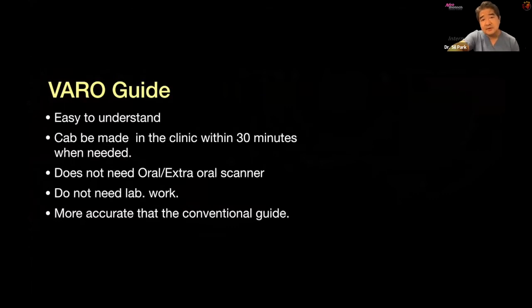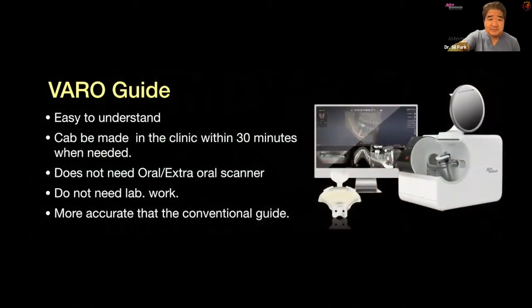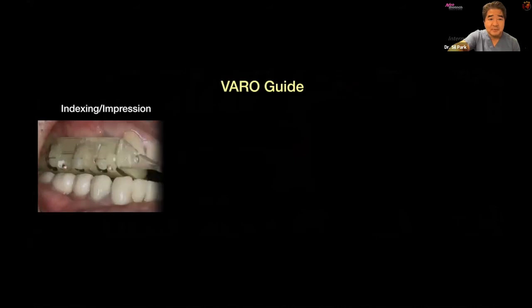We discussed those tolerances, right? The gap between the guide and tools, and the gap between the drill and sleeve, has some built-in errors. But the VARO guide overcomes that. So those are the VARO guide systems. So let's go a little bit more into it.